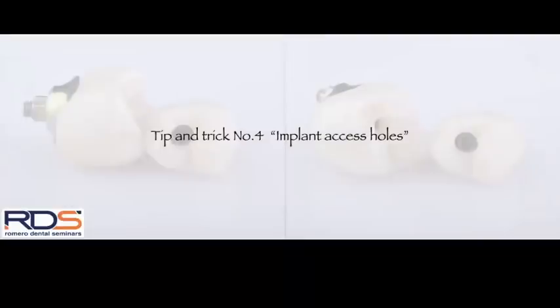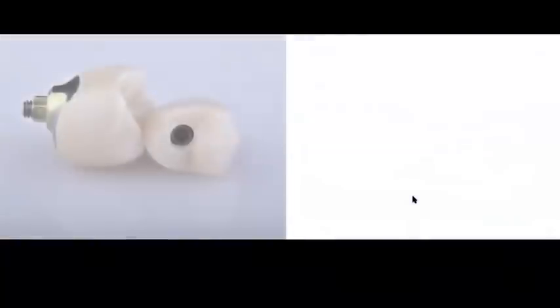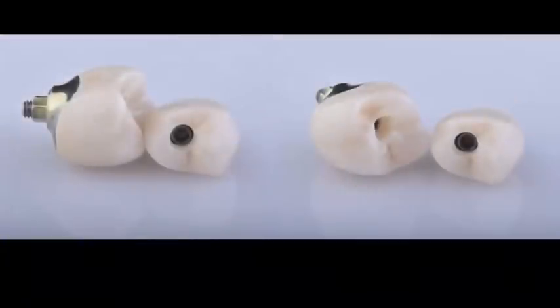My final tip and trick for today is going to be implant access holes. And the reason why I add this here is because we all know that when we restore implants, we normally have to seal that access. If it's a screw retained type of prosthesis, we are going to have to seal that access using a resin composite. And again, I'm going to now use the same concepts that I have shared with you today on natural teeth. I'm going to use the same concepts for the access holes on my implant restorations.